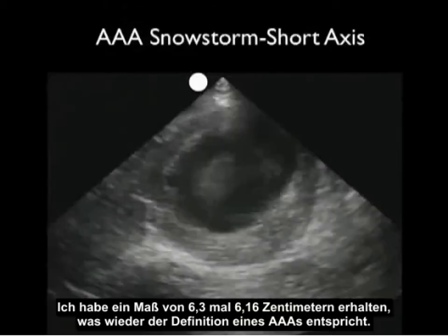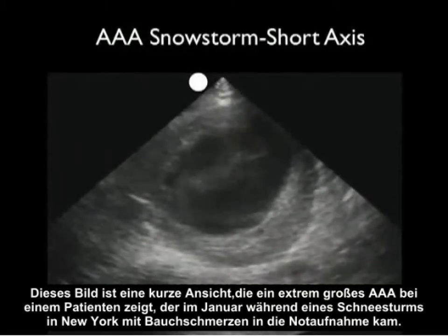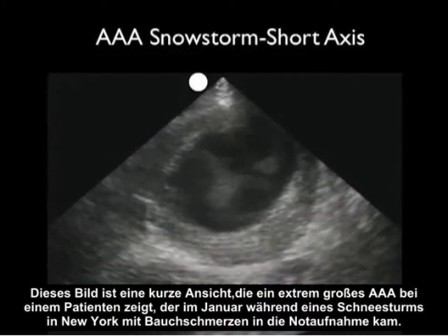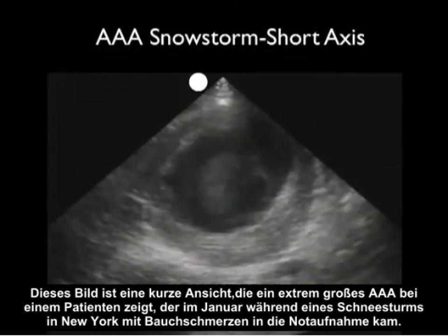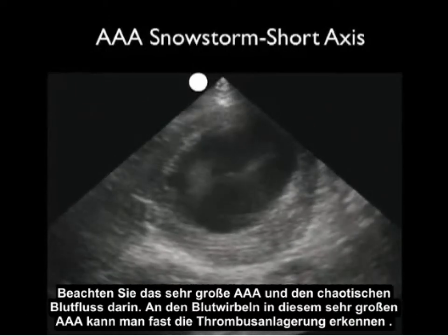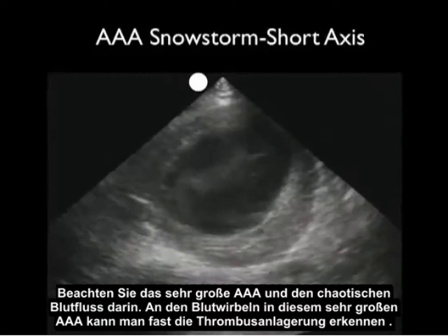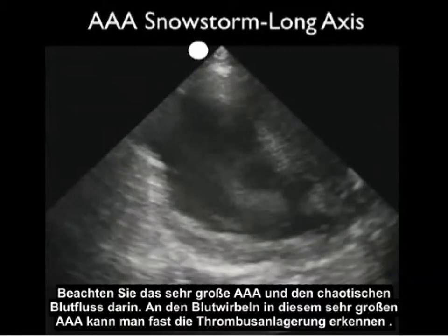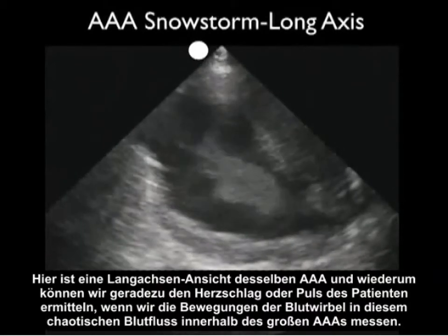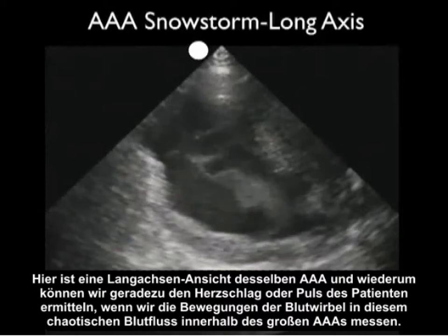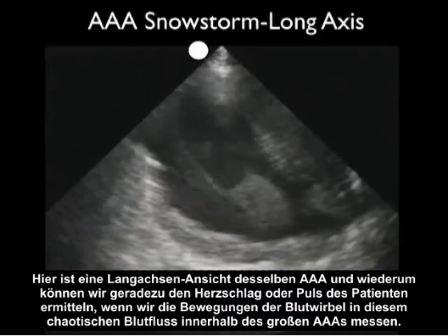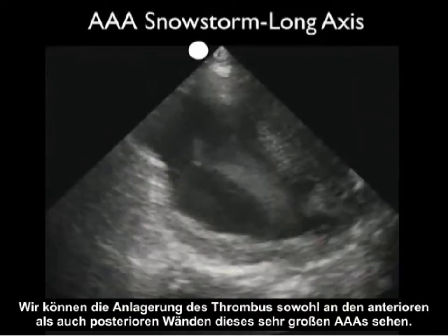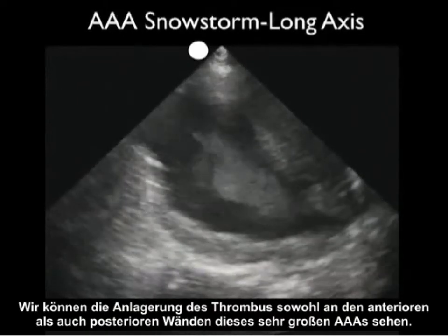This image shows an extremely large AAA in a patient who presented to the ED with abdominal pain during a snowstorm in New York City in January. Notice the very large AAA and the chaotic flow of blood inside — you can almost see the thrombus deposition from the swirls of blood. Here's a long axis configuration of the same AAA, and we can almost take the patient's heartbeat by measuring the movements of the swirls of blood within this chaotic flow. We can see the deposition of thrombus on both the anterior and posterior walls.